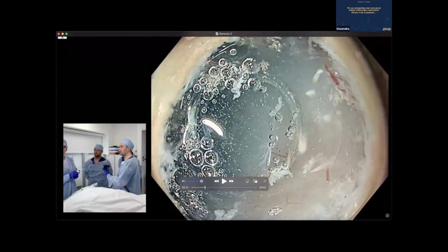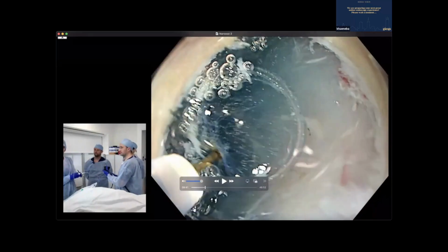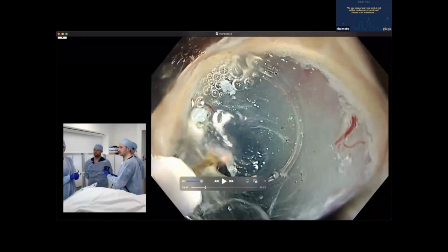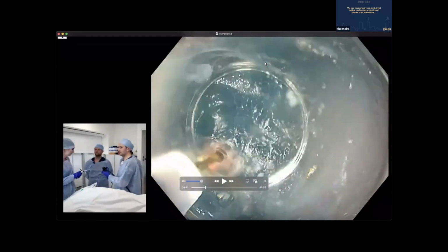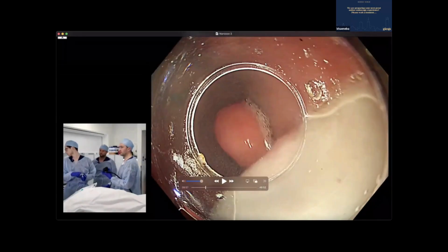So then I'm like, okay, I don't want to go down there. I want to go up. So then I intentionally look up during the procedure, and I'm really dragging the scope up, even towards the lip of this tunnel, dragging it up to force the tunnel to go in the direction I want it to go, right? So there's where I want to go. I think it's not bad.